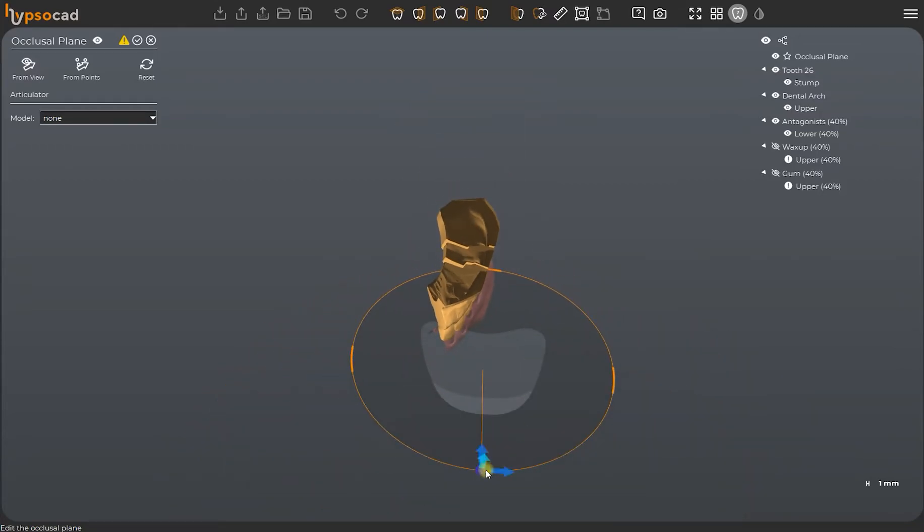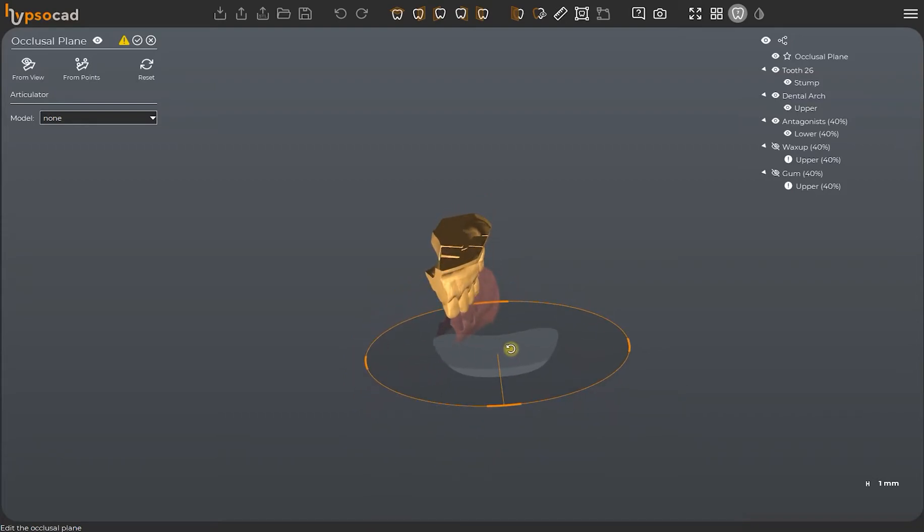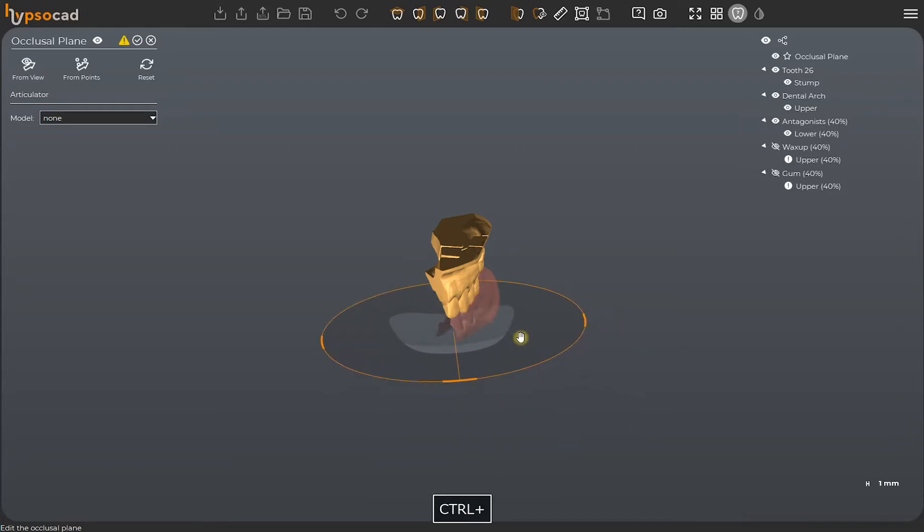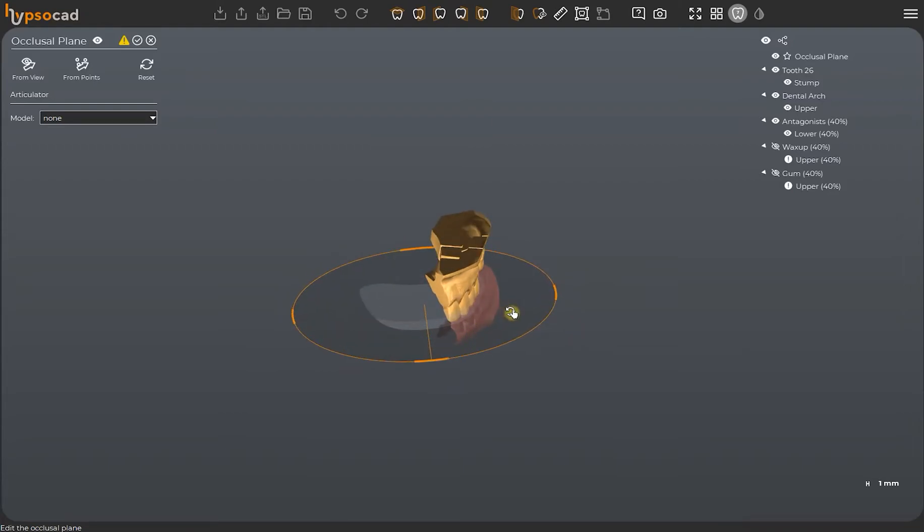Moving the mouse on the plane activates four movement arrows, thanks to which you may correctly position your occlusal plane. To modify the plane's inclination, you just need to press and hold on to the area you want to edit. By pressing and holding control as well, you can move the plane around on the working space.